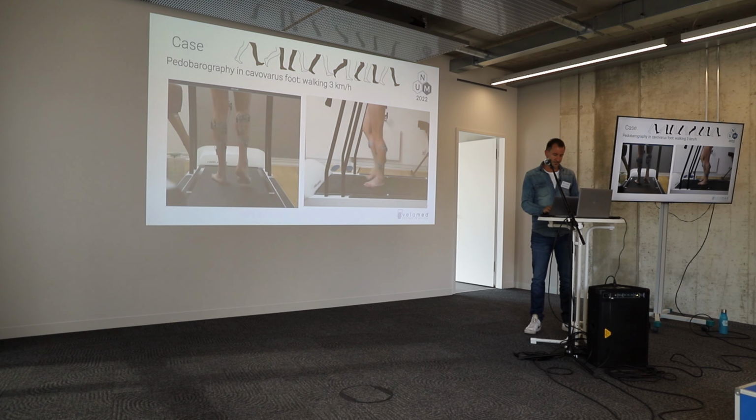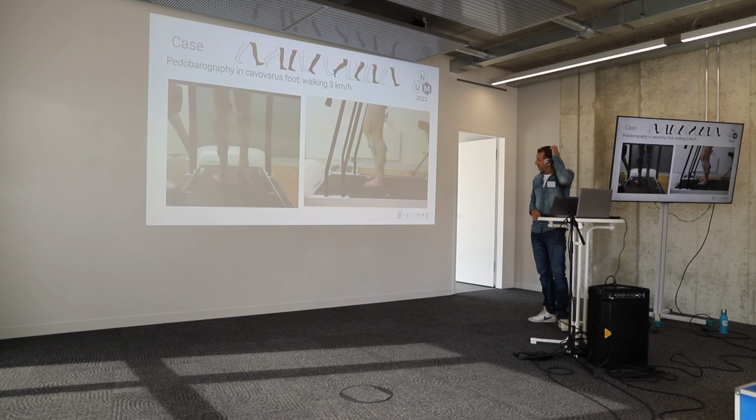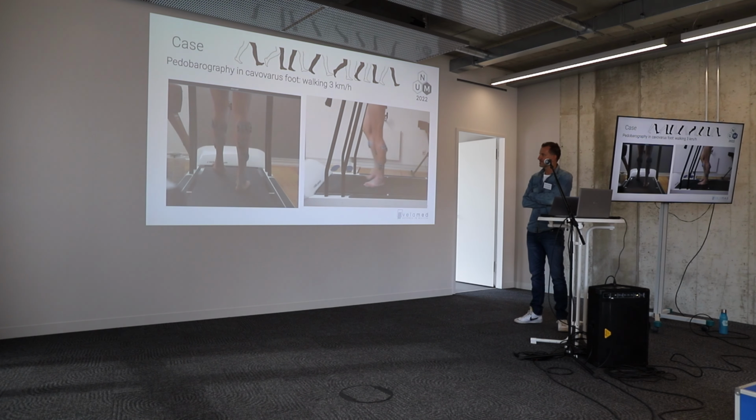So let's see his gait analysis. I hope you can see it. If you describe it right now, you can see the first contact is not the heel, on the left and the right side. The first contact is the lateral forefoot, the base and the head of the fifth metatarsal. You see a massive hindfoot varus.